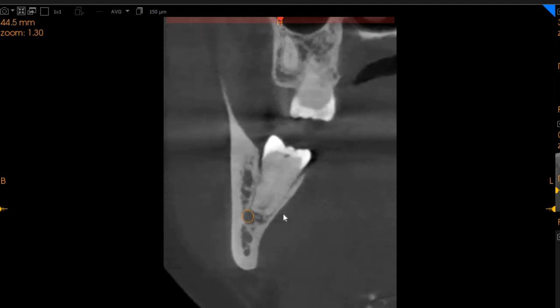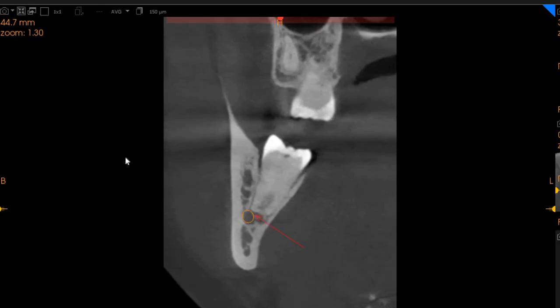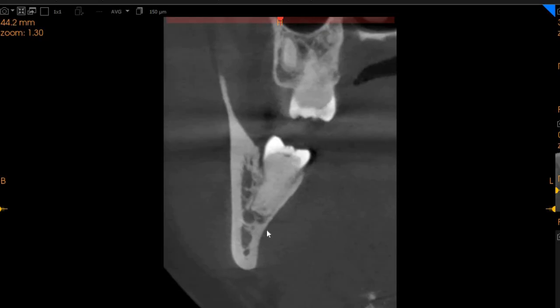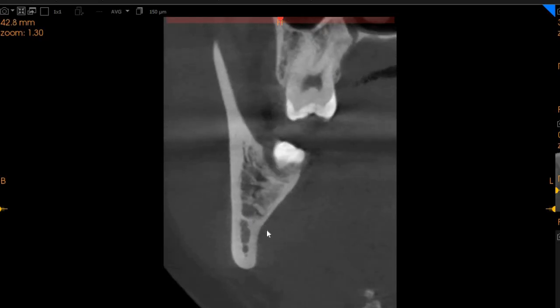On the distal root, however, the situation is slightly different. We are very closely in contact with the inferior alveolar nerve, however we do not see any compression. This is where we can see the distal root and its association with the inferior alveolar nerve.